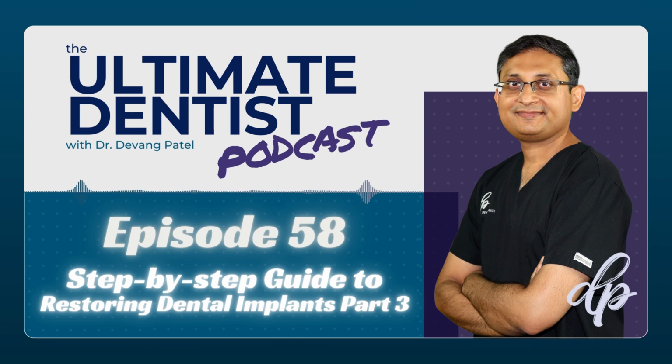Some implants will have different color coding of the impression post, so the technician will know straight away, but you want to avoid guesswork. So make sure you tell the technician what it is. You then need to tell them the shade of the crown. So you will generally take clinical photos, do a shade match, and send the photos to the technician.